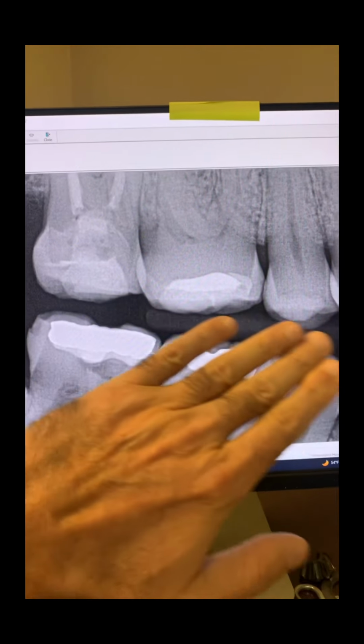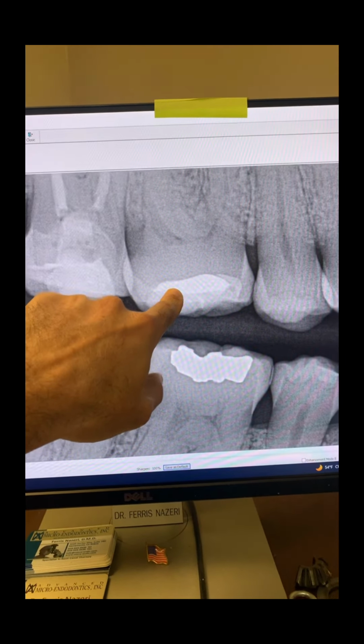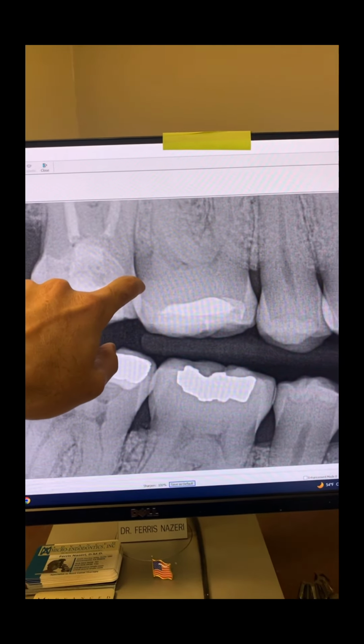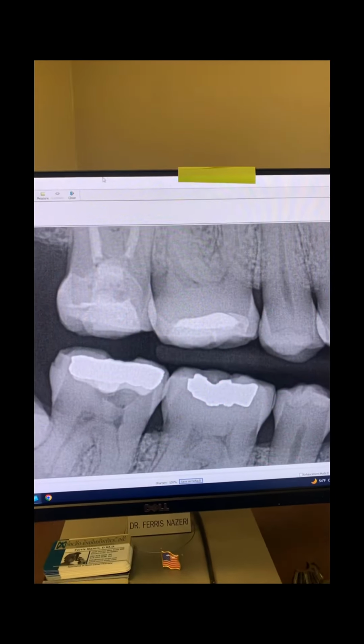I examine all her teeth. Number 3, within normal limits to percussion, palpation, and cold. And you can see the bite wing, and you can see the decay here, right? So very likely tooth number 3 is responsible for her sweet sensitivity.